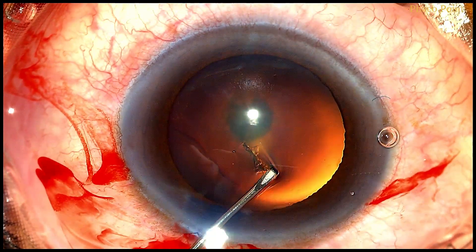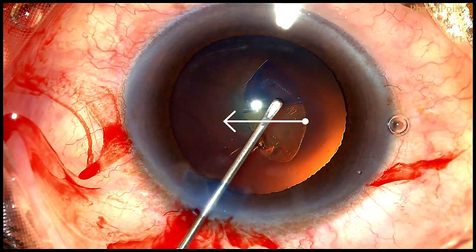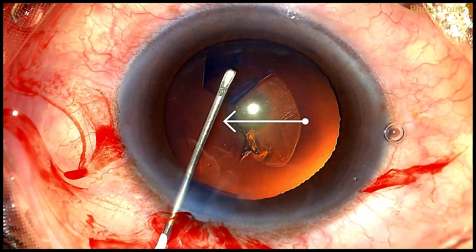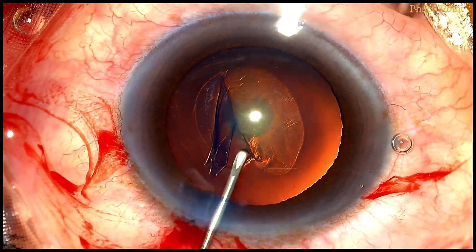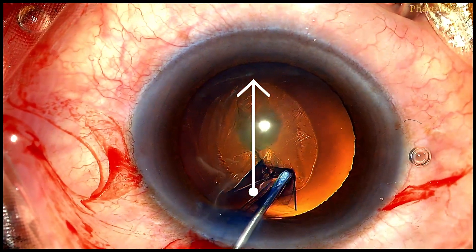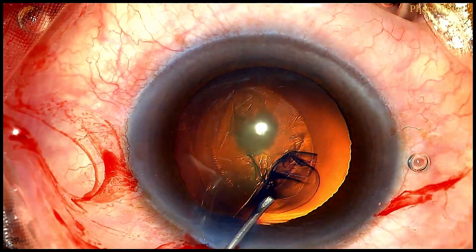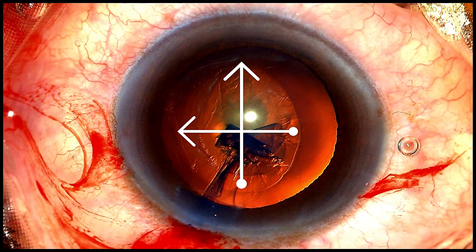Let's now see the creation of the oval rhexis. It's important that we maintain the horizontal diameter of this rhexis slightly smaller — that would allow for the placement of a three-piece lens horizontally if required. The vertical diameter, however, can be a little longer — long enough to allow for ease of manipulation intraoperatively, but short enough to allow for coverage of the optic edge on either side.